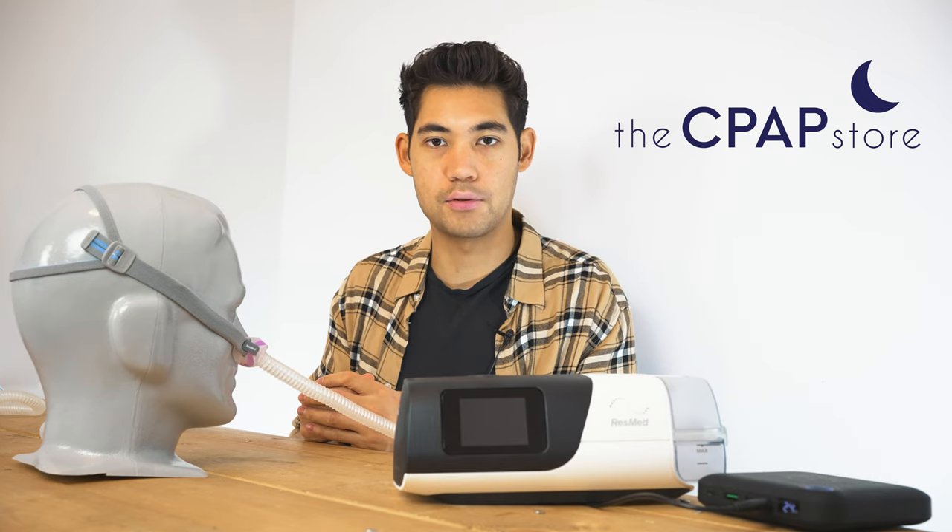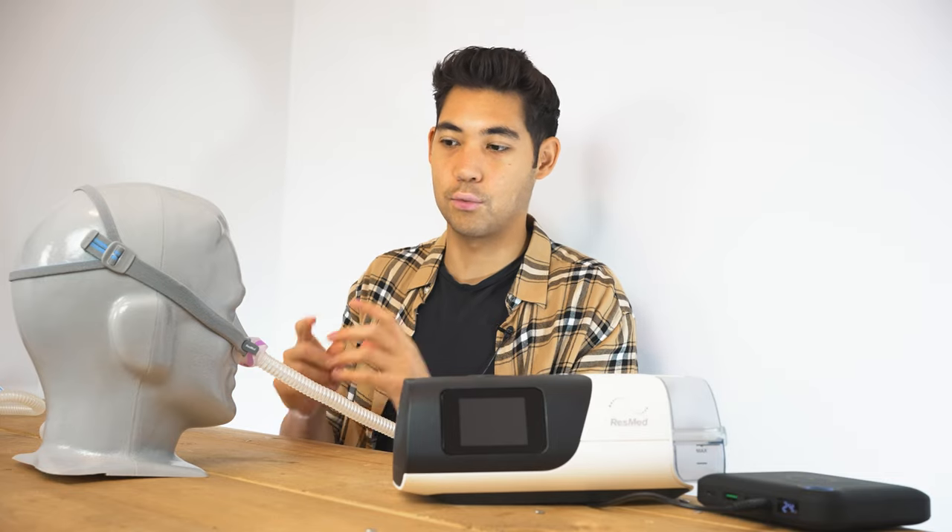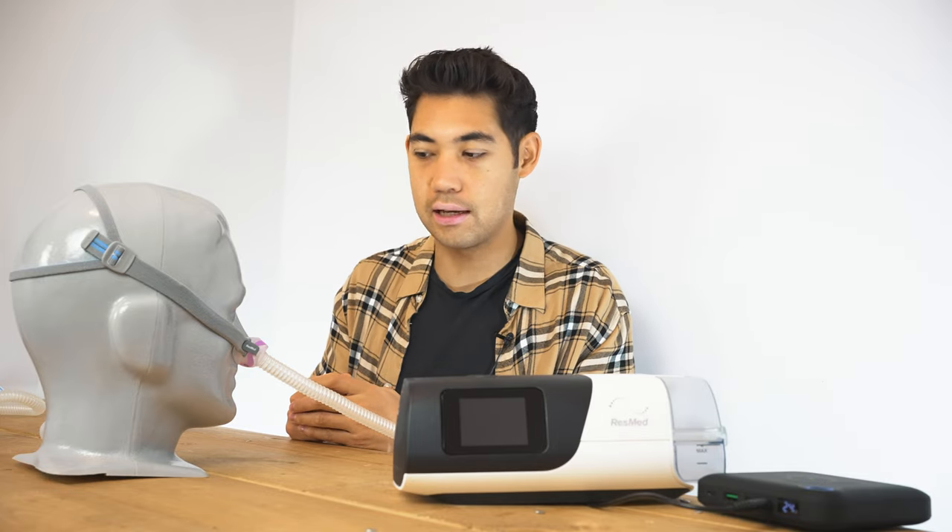Hi everyone, my name is Tristan from cpapstore.ca and the cpapstore YouTube channel. Today we're going to be looking at the ResMed N30 mask.